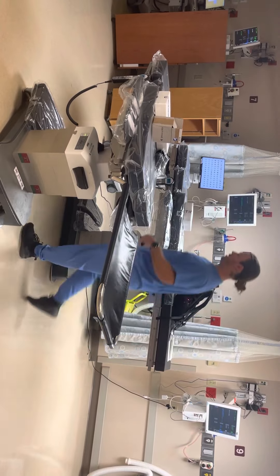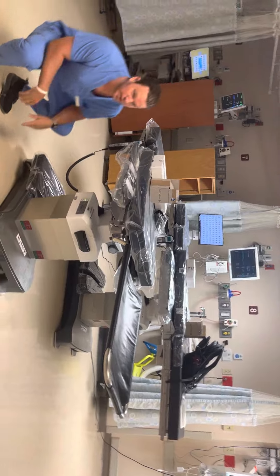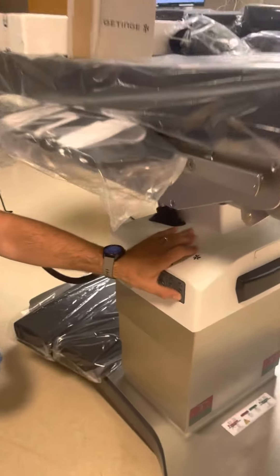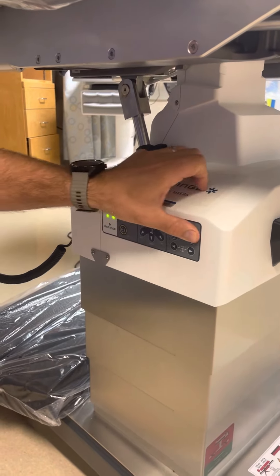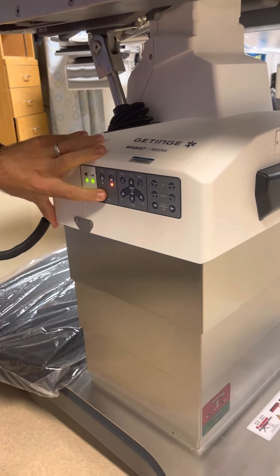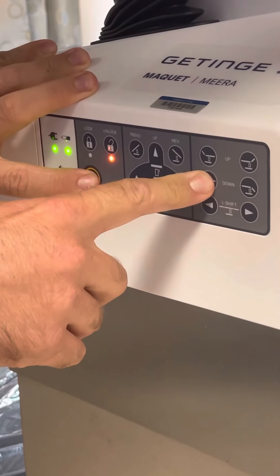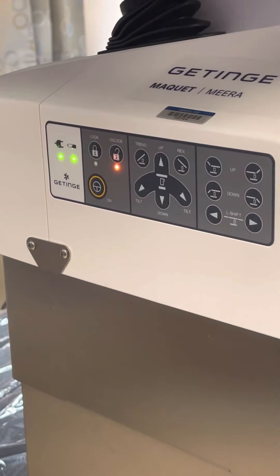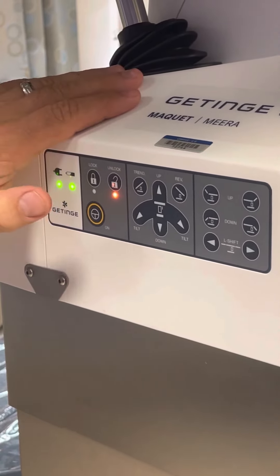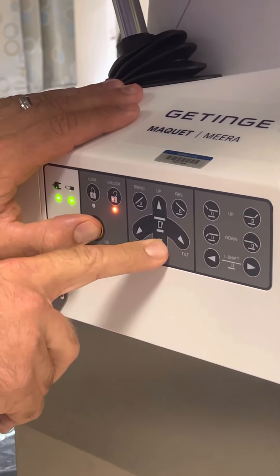On to the remote. We'll go over the column settings real quick first. Pretty much everything on that remote you can see from here. However, it will not work until you are hitting this button — this is what allows you access to do everything. That way, if you're standing next to the table and your knee accidentally bumps it, you are not changing the orientation of your patient. Hitting this then gives you access to do whatever you need.